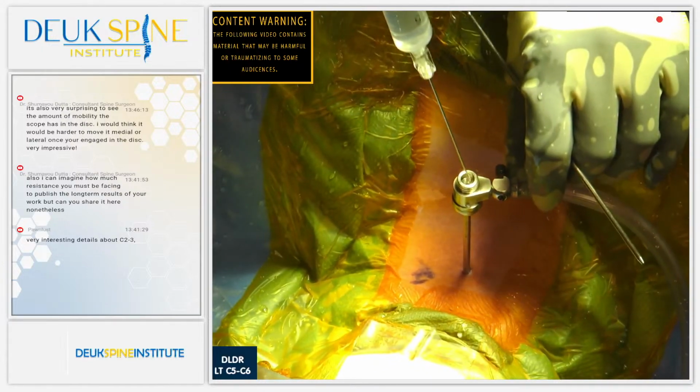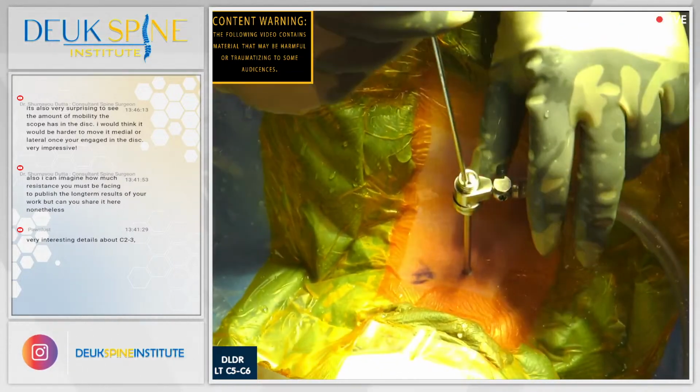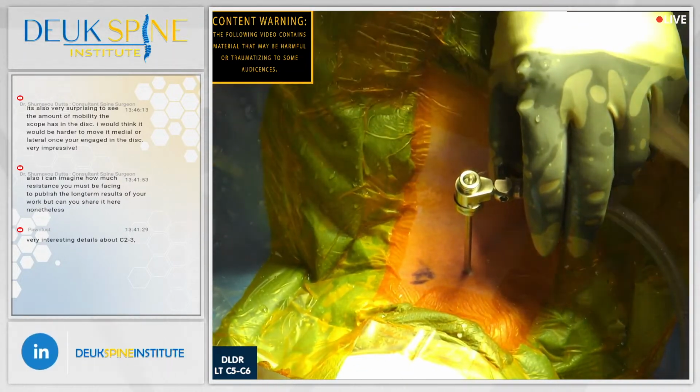All right, so Henry, go ahead and show our audience facet joint pain while we take the tube out and put on the bandage.